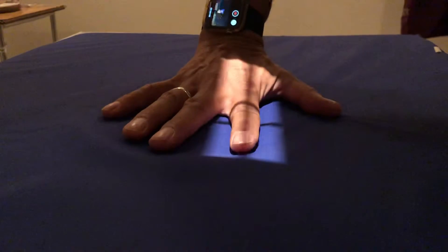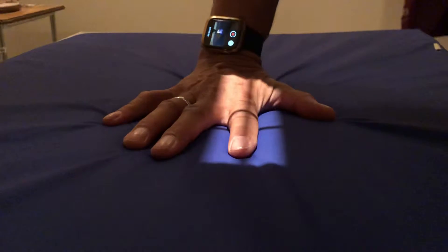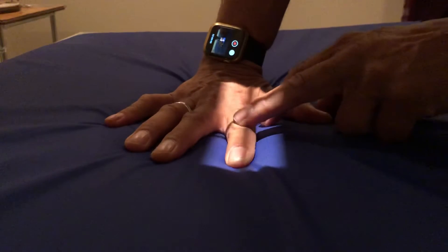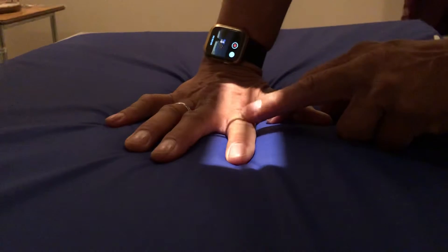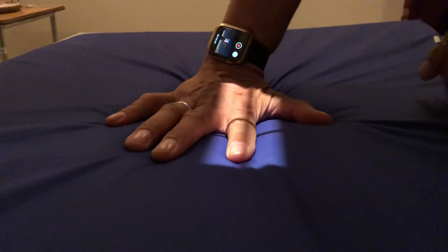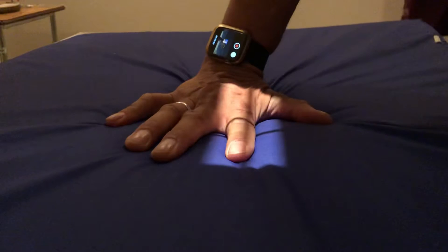First one, PA. You're just going to keep your palm as close to the table as you can, flat out. You're going to center at this first joint here, which is the PIP, and bang, got it.